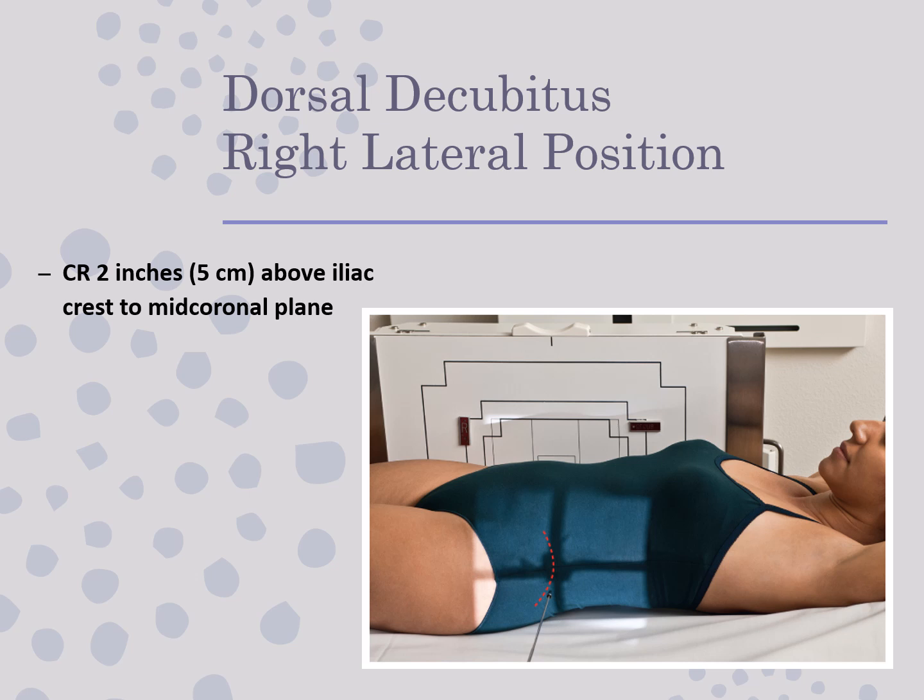Can also demonstrate an umbilical hernia with this position. An umbilical hernia would be towards the umbilicus, or the belly button. The patient should be lying on their back. Again, a minimum of 5 minutes just so that everything layers out.